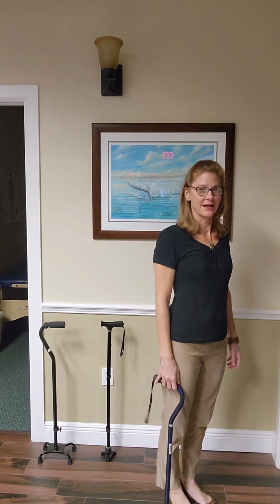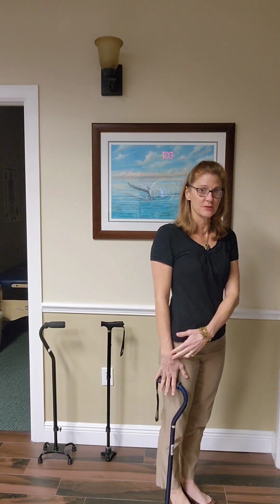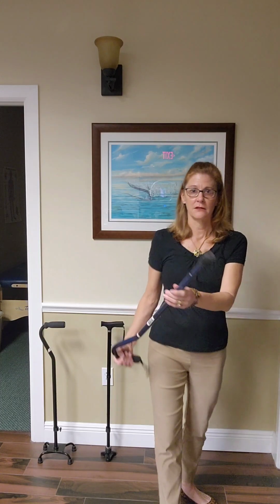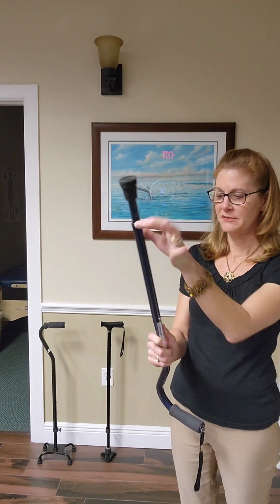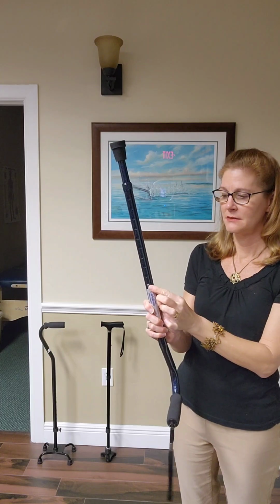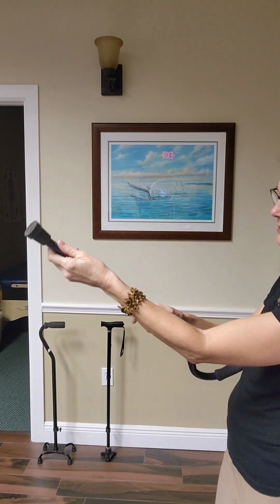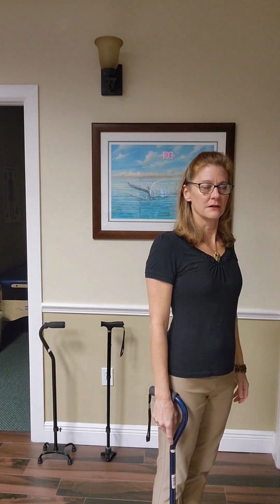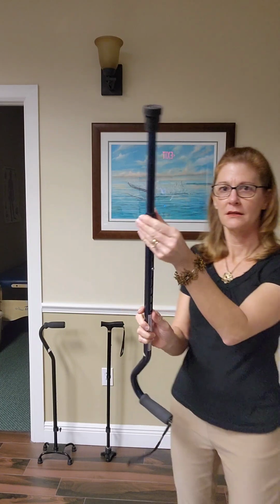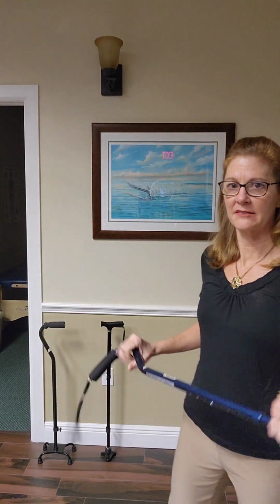First of all, you have to make sure that the cane is the right height. When you're standing with good posture and your arms dangling by your side, the handle of the cane should be at your wrist level. This is way too short for me. So, at the bottom of the cane, you have to unscrew this piece, and there's a button here that you push in, and there's different holes along the way. You can adjust to the proper height. I'm gonna guess there. Here we go. Then I go back and I screw this bottom piece. This technique works for all 3 canes. That's how you know it's the right height.